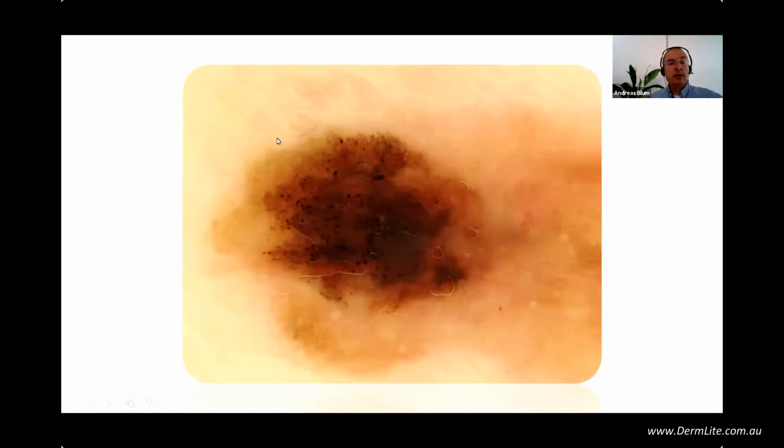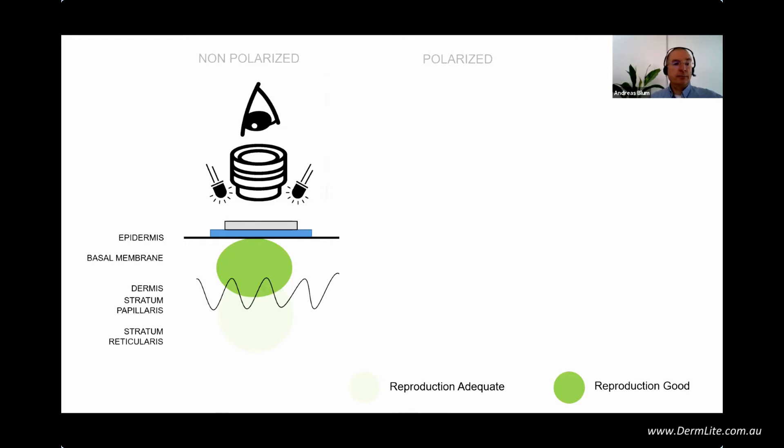But here there's a typical pigmented lesion with a lot of dots, a little bit of atypical network — broadened network — and a very short hint of pseudonetwork and pseudopods at the periphery. This gives us a hint: there's something malignant. This should be a melanoma. So only based on lights and physics, we know how to approach such a lesion and see inside up to two millimeters of the epidermis and basal membrane. To summarize: with non-polarization using glass plate and immersion fluid, we have a better view of the upper part of the skin — epidermis to basal membrane.